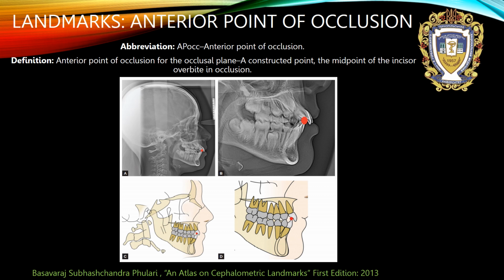Anterior point of occlusion. For the occlusal plane, a constructed point, the midpoint of the incisor overbite in occlusion, like on this scheme. It is the point of contact between the upper central incisor and lower central incisor.